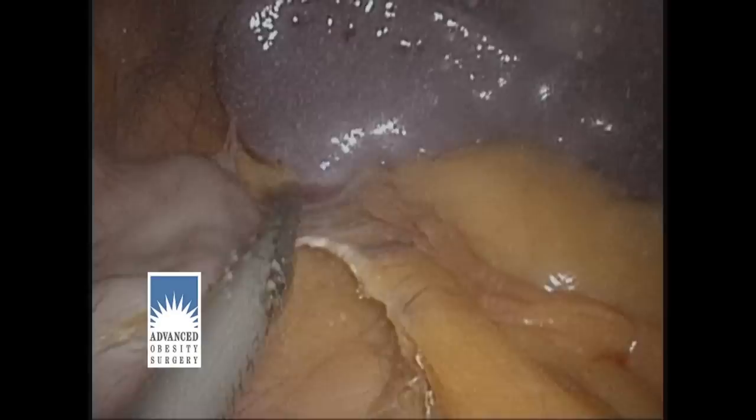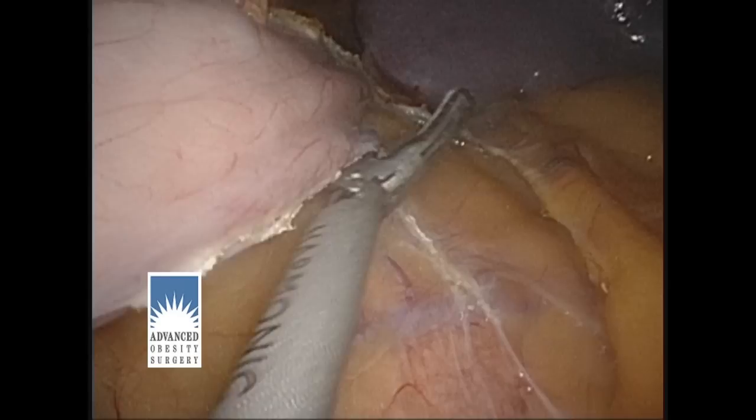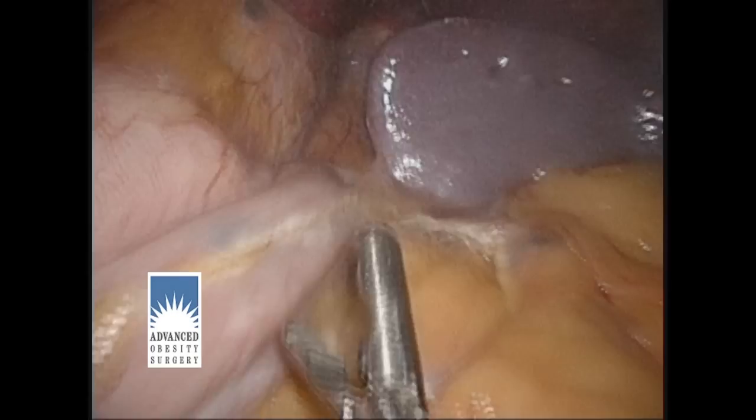We also take down some of the attachments that hide underneath the stomach so that we can be sure we're exposing the entire stomach. We also want to be sure there's not a hiatal hernia, and if there is, we'll reduce that at this point in the procedure.